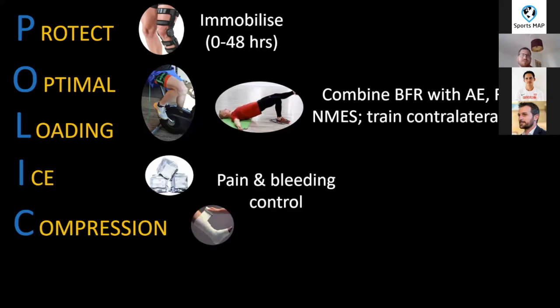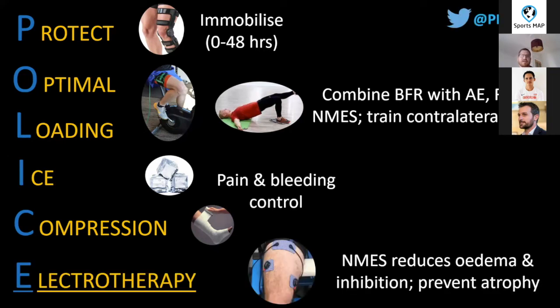Ice and compression for pain and bleeding control, especially within the first 2 days. And instead of elevation, I'm going to put in electrotherapy. Here we can apply electrical stimulation straight away. Aims are reducing edema, preventing inhibition, and preventing atrophy.